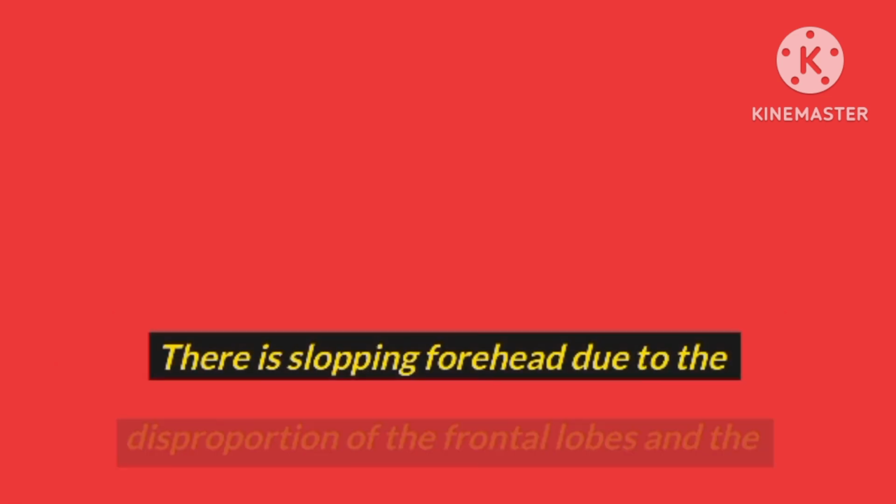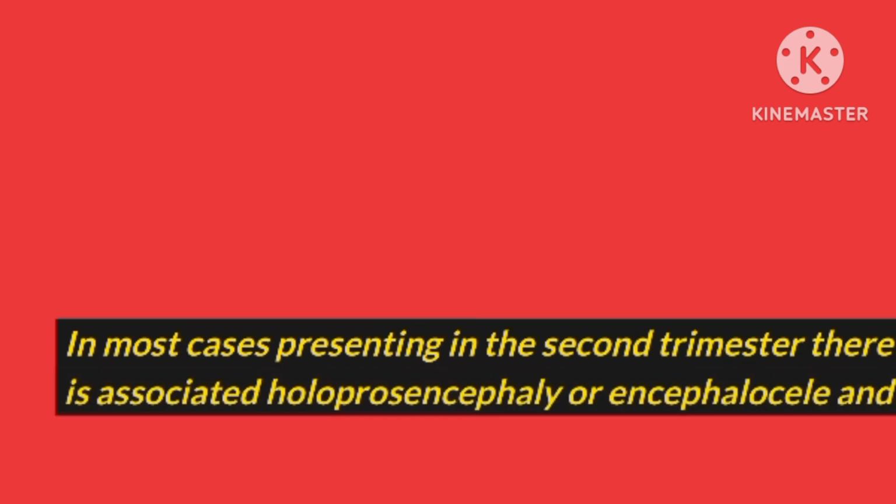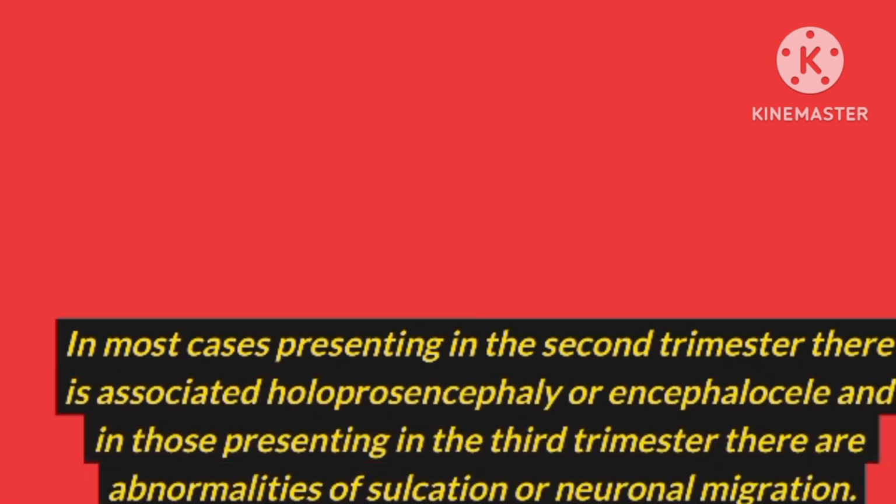There is sloping forehead due to the disproportion of the frontal lobes and the face. In most cases presenting in the second trimester, there is associated holoprosencephaly, or encephalocele, and in those presenting in the third trimester, there are abnormalities of sulcation or neuronal migration.